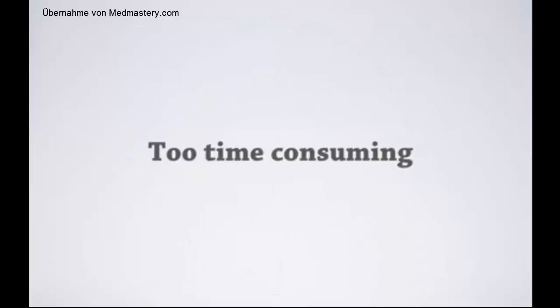However, this is way too time-consuming and really not worth the effort because there are only a few situations where knowledge of the axes really makes a difference, and we'll get to those a little later. But in almost all countries, it is the rule to include information about the electrical axes in a complete ECG report. So we should be able to find the most important abnormalities of the electrical axes, and here is a simple trick how you can do it.